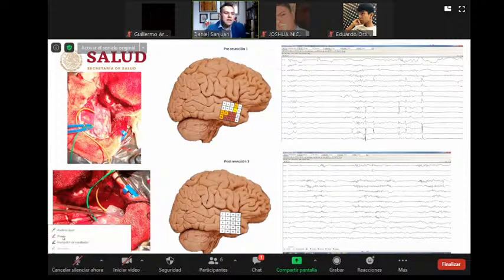I'm going to use the laser. Sorry. The spikes in this area, and then again, and the resolution in time is only 1 second here. So you can imagine this is 1 second. So it's in real time.